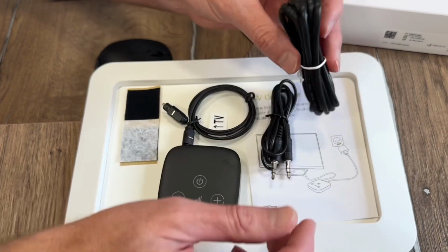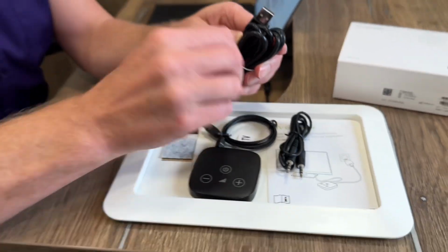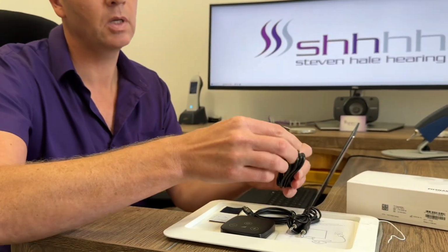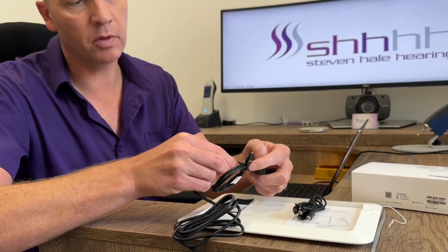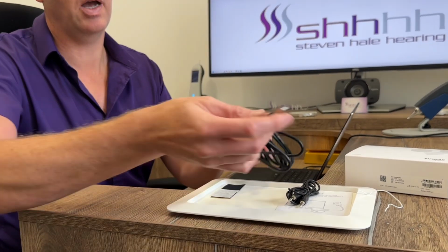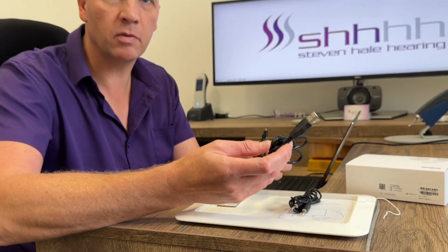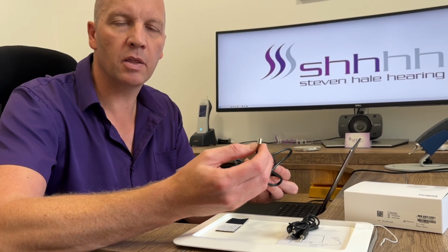You've then got your power cable as well, and if we undo the power cable first of all, you've got two sides to that. The smaller side will go directly into the back of the device, and that will plug into the back of the TV. Again, if you haven't got a USB on the back of the TV, that can be powered directly by a 3-pin plug, which we can supply as well.